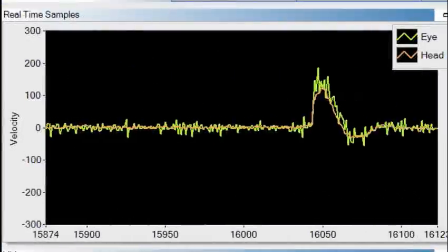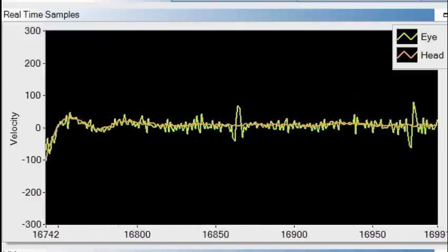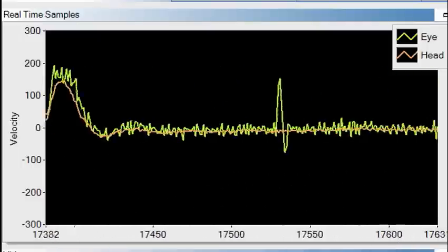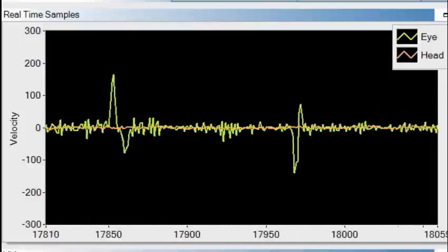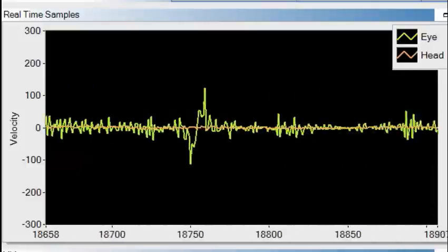The real time trace window allows you to monitor both head displayed in red and eye movement displayed in green while performing one head impulse test. By monitoring the real time trace, you can make sure the patient is cooperating and staring at the fixation dot.